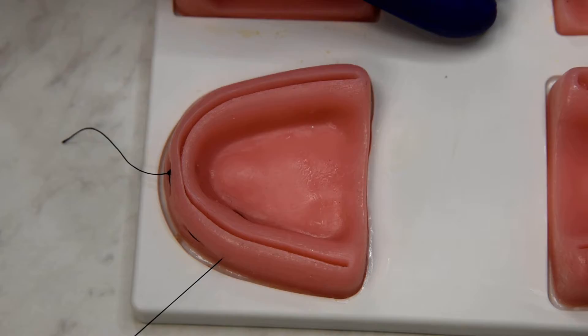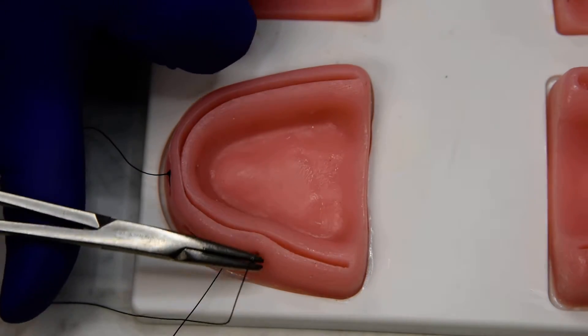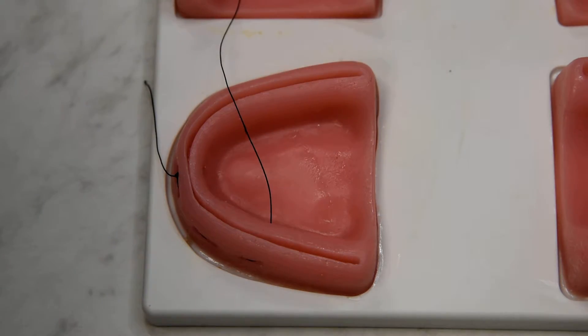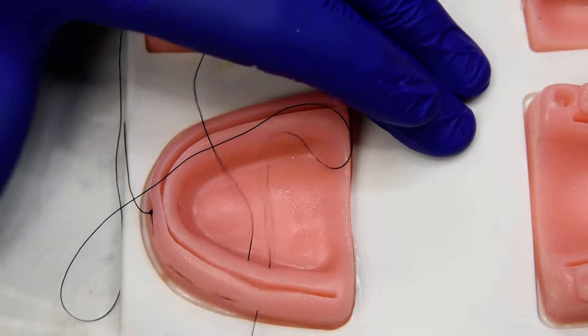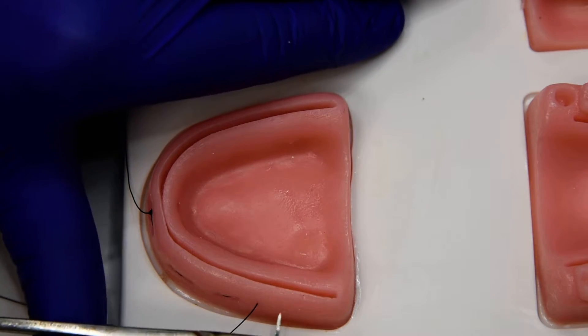And usually this is a quadrant. So this is a continuous horizontal mattress. We're coming back with a little buccal bite, so none of the sutures are crossing over the incision line. You can see these are all mattress style sutures.